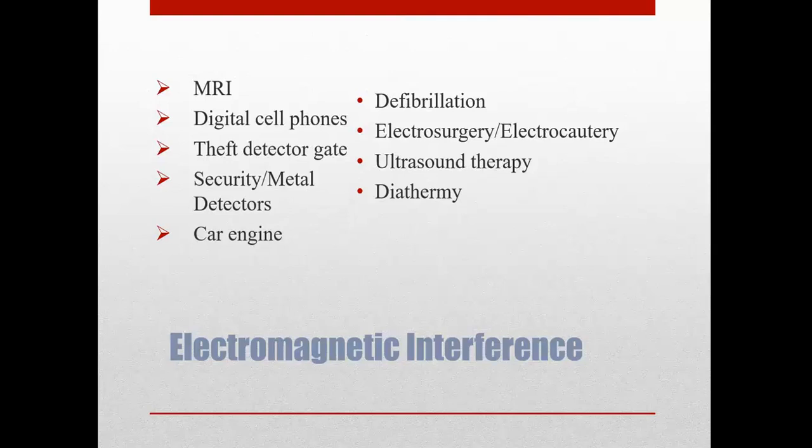The patient must present their pacemaker ID card when they're in situations like this. Otherwise, they can be deemed non-compliant. So it's always important that we encourage patients to keep those cards with them. And then heavy-duty electrical power equipment, such as arc welders, electrosurgical tools, bending over a running car engine, all of those things need to be avoided. Patients should be provided with the package of information from the pacemaker, and it's going to include all of that education on the ID card.